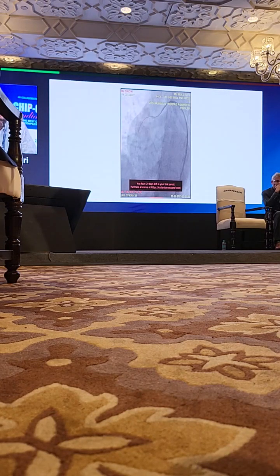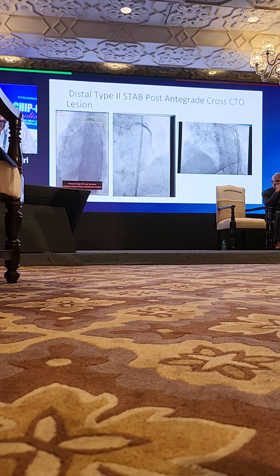At some point I felt resistance and took out the guide wire. Checking with the microcatheter, I found that I was in the false lumen. So I took an opposite side puncture and did a check shot to see where the lesion was.